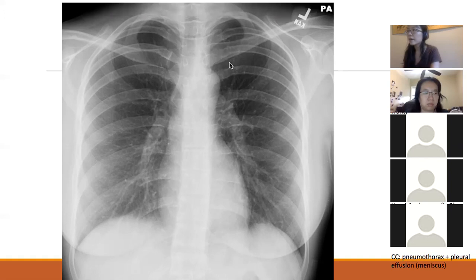Okay. I have a question. Sure. Can you repeat about rickets? Did you say it had something to do with the spine, or is it just the legs?